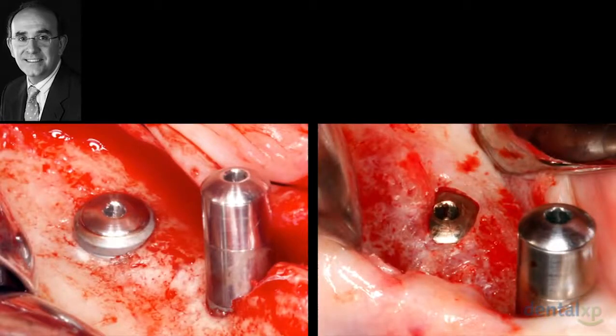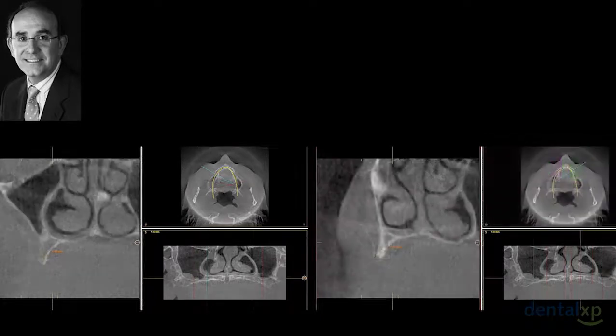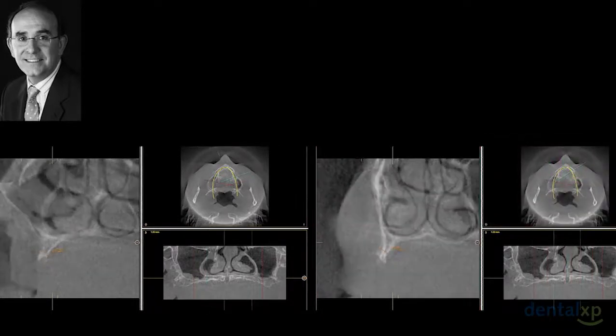These are the situations when I do the second surgery, which we observe in 90% of the cases, that the cover screw is completely covered by new bone. What about the upper maxilla? In this particular case, the patient has a really narrow crest and also only 3 or 4 millimeters of residual crest in the molar area. What is our approach in these cases?